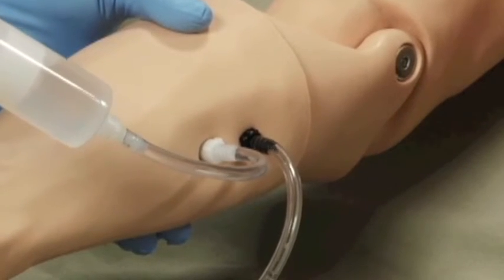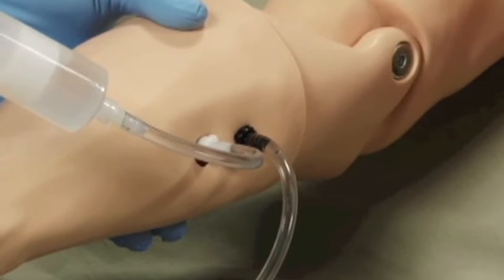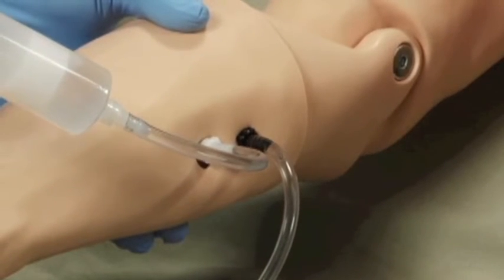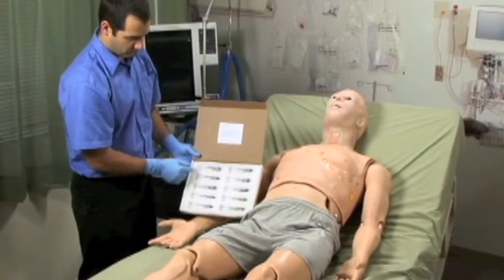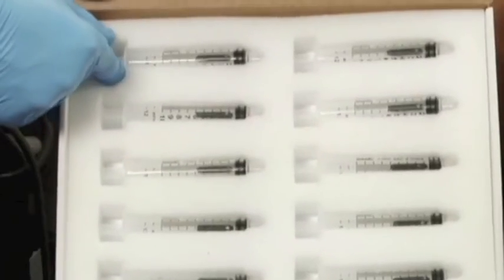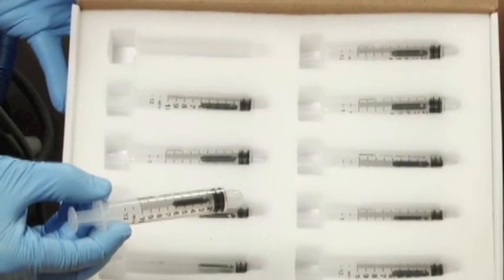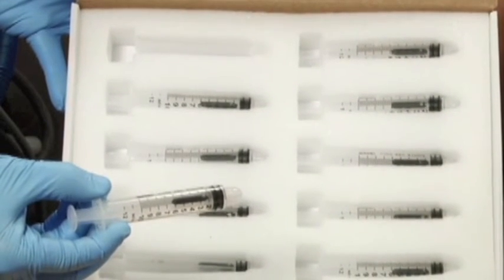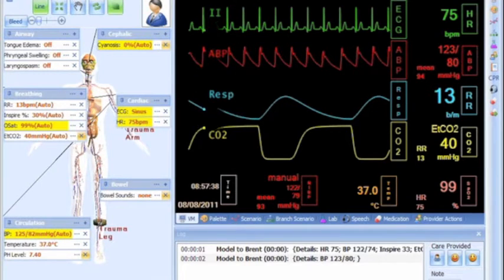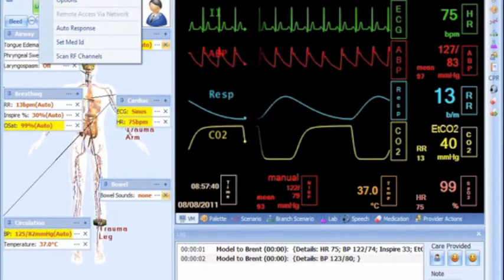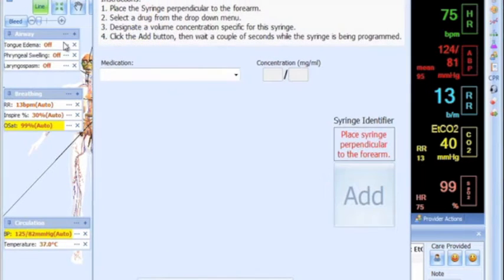Now that the system has been purged, the drug recognition feature is ready to use. Each Howell is shipped with a package of syringes, and every syringe has a unique RFID tag. Using the GIGA software, each of these syringes has to be programmed with a specific medication name and a corresponding concentration.